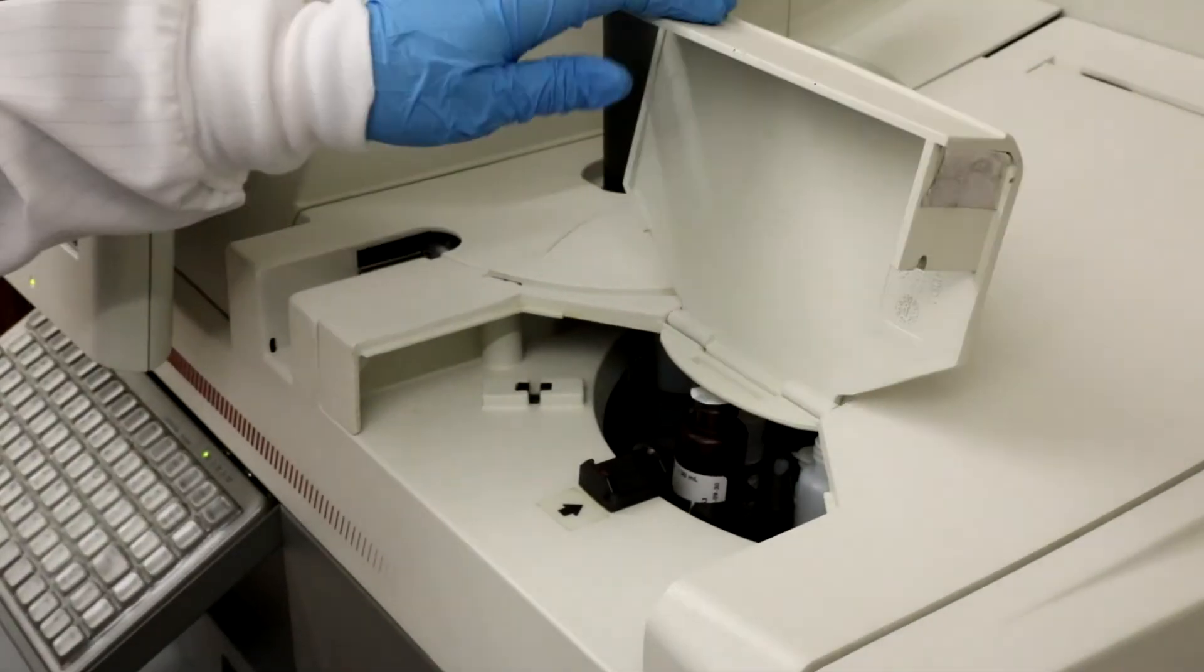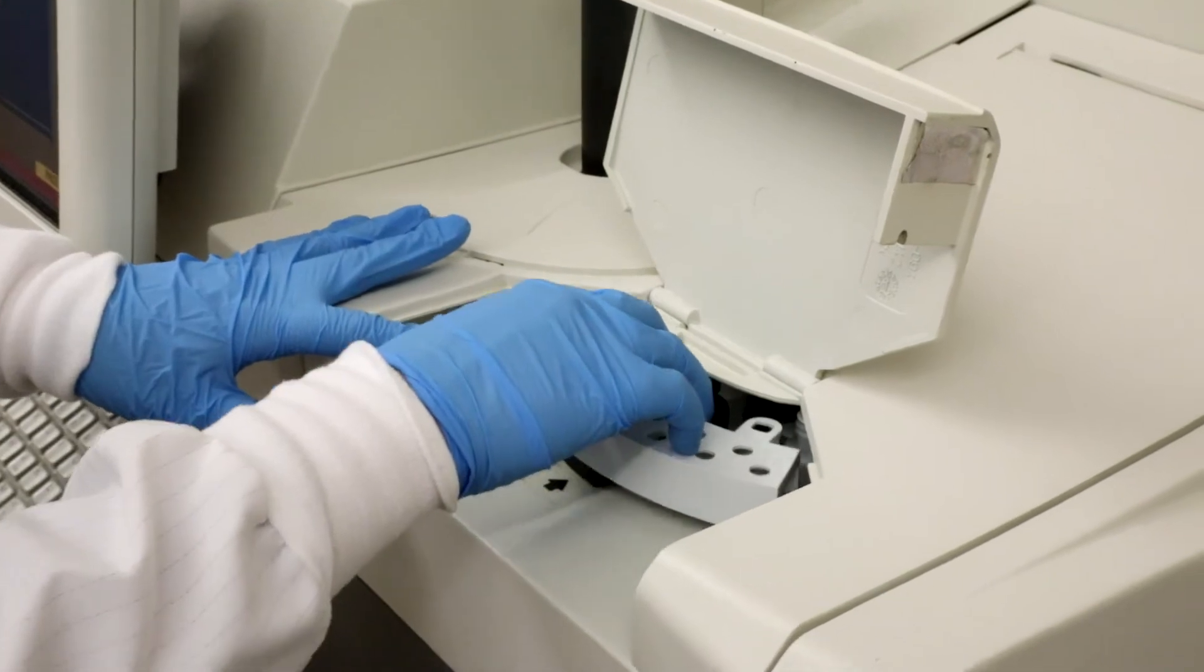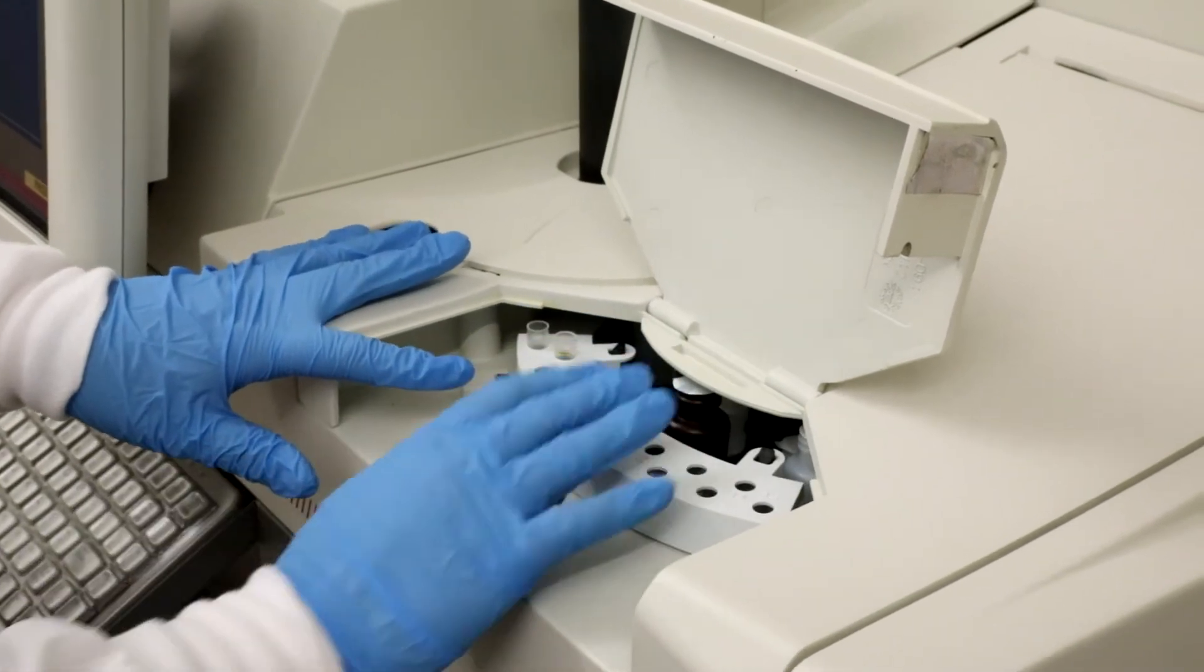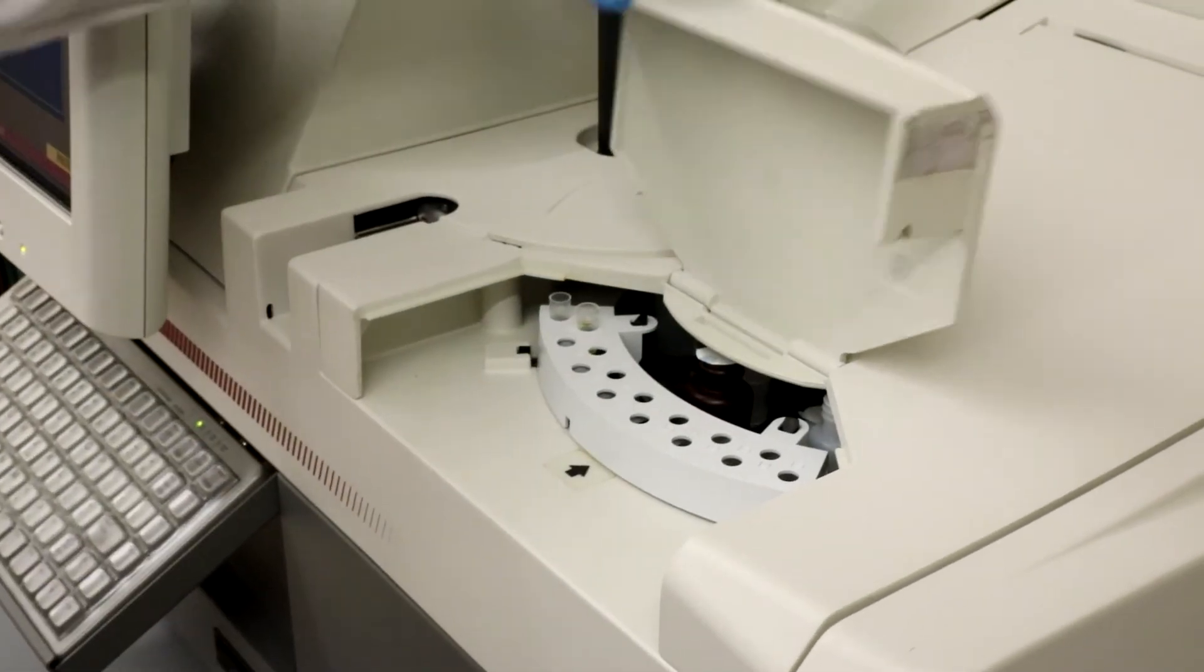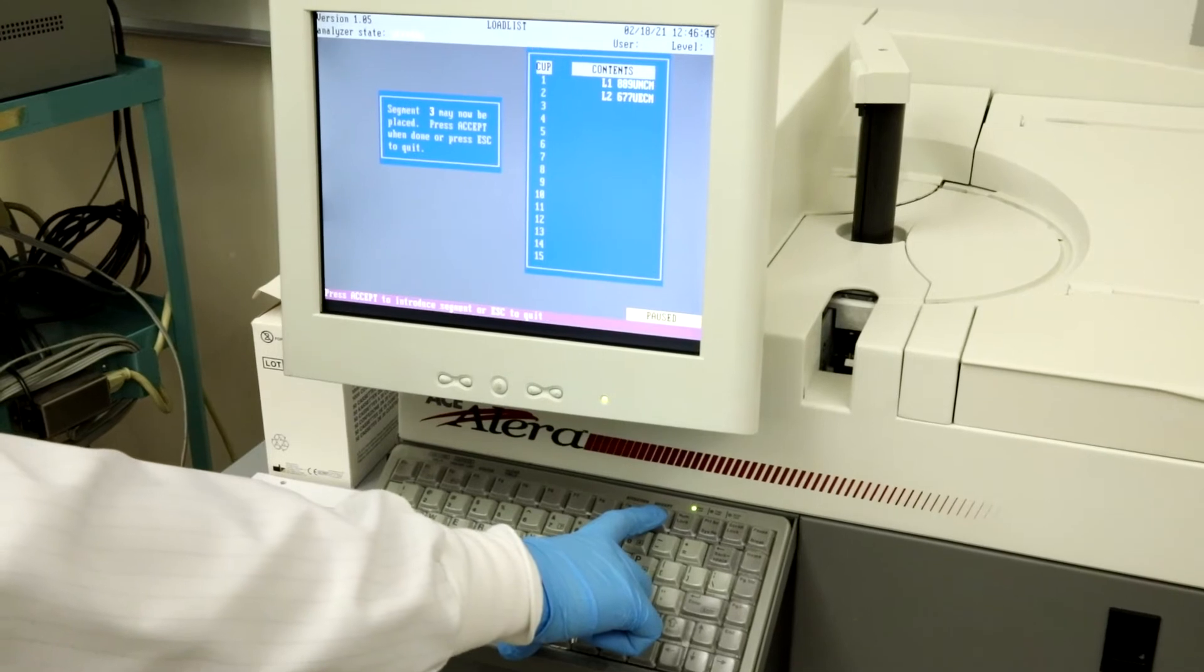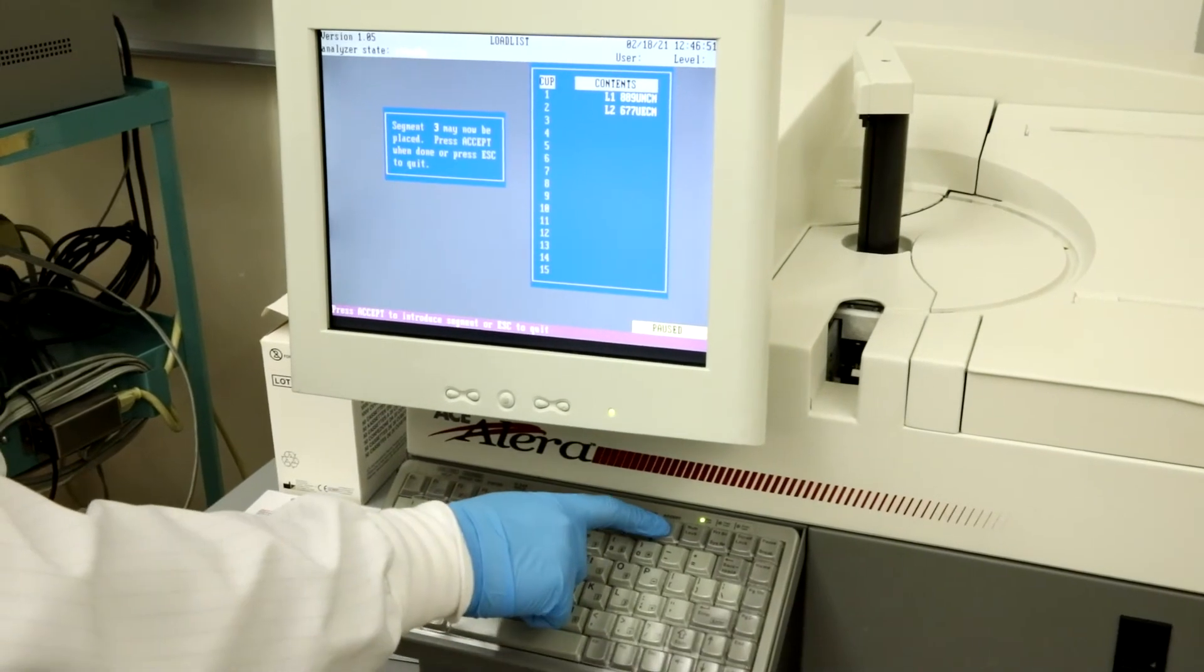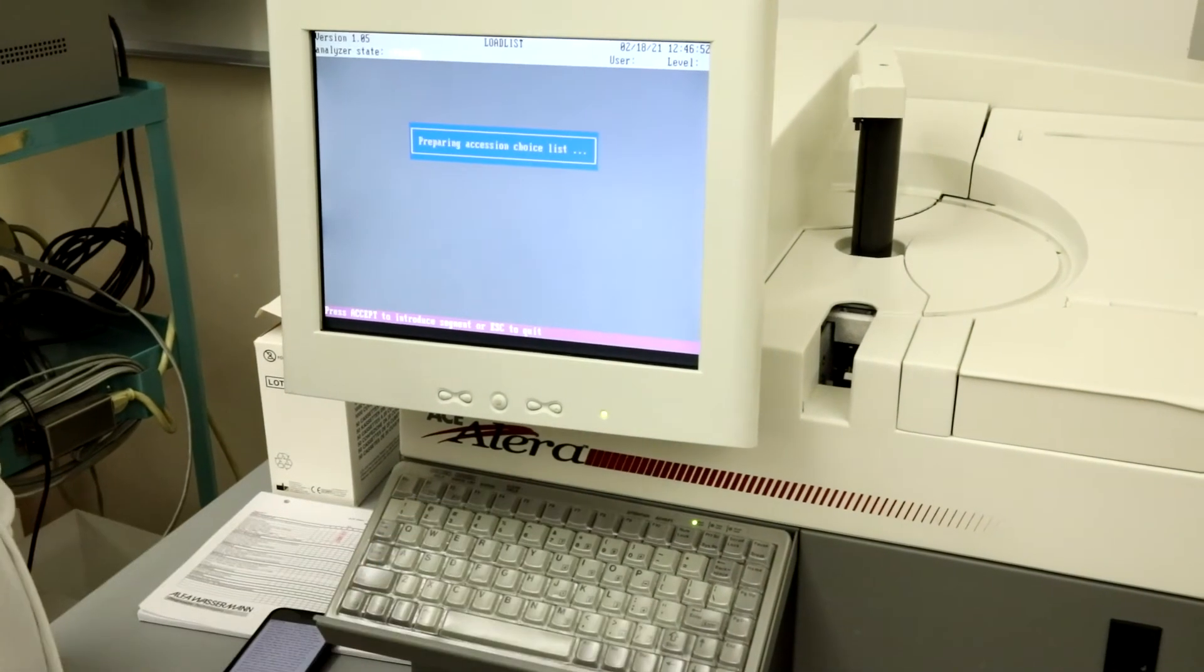Wait until you hear the door unlock before you open it. Place the segments on the black horns then close the lid and hit Accept, F10. QC will begin running.